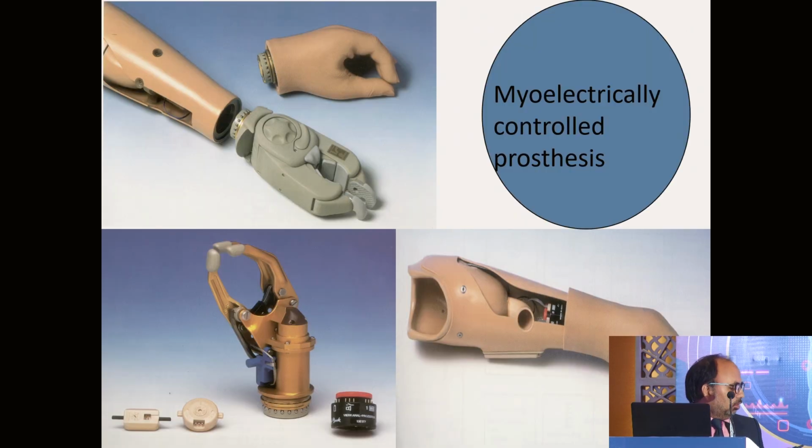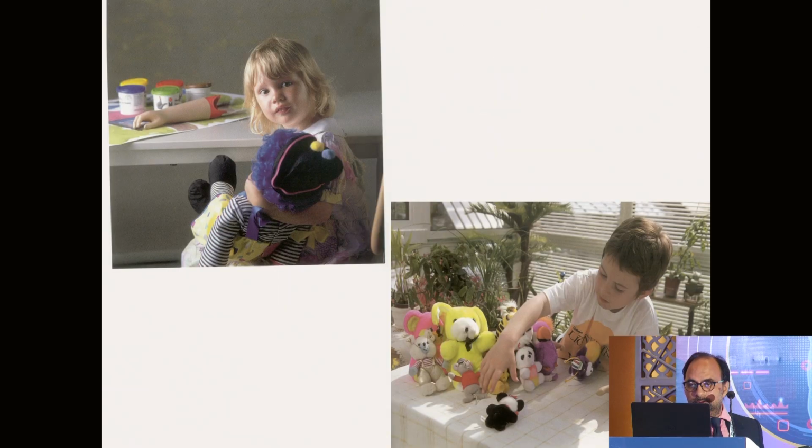And this one is a myoelectric one. So this is controlled with battery, and this is attached like this. So this is a person who is using it. So if you see cosmetically, you are not able to identify which hand he is using or not using.